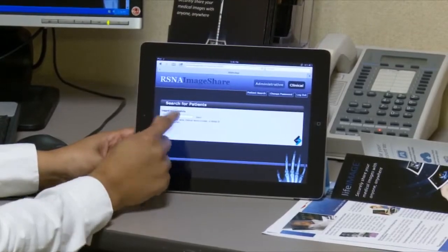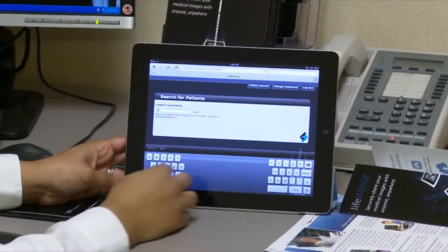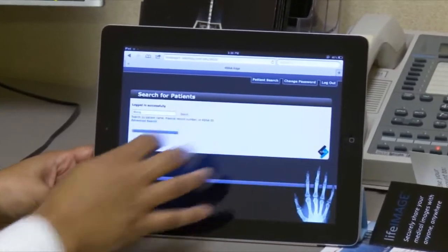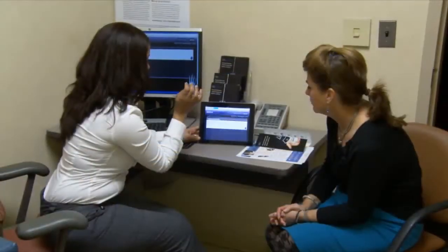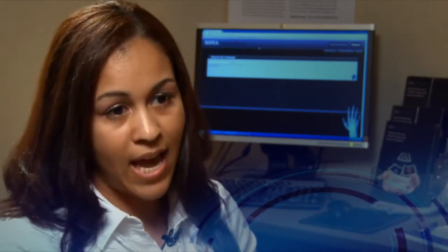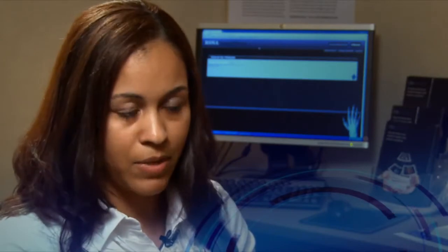They provide patients with an ID and password that they can use to retrieve their studies into an account they create on one of the participating PHR systems. A help desk is available by phone or internet to help patients through the process. One of the great things that patients love about the RSNA Image Sharing Network is that they can immediately have access to their studies and their images.